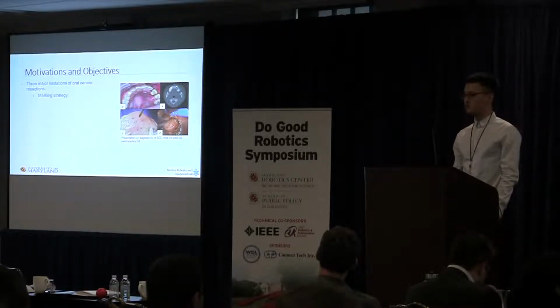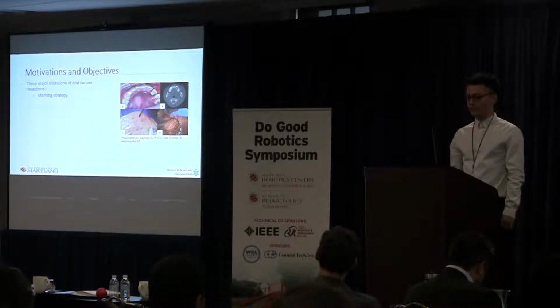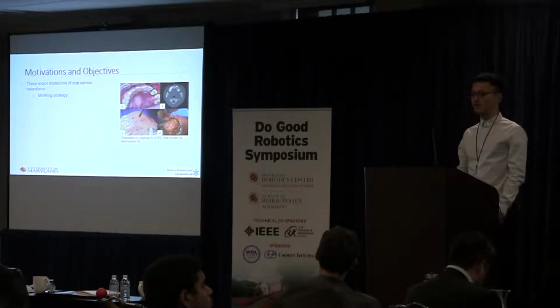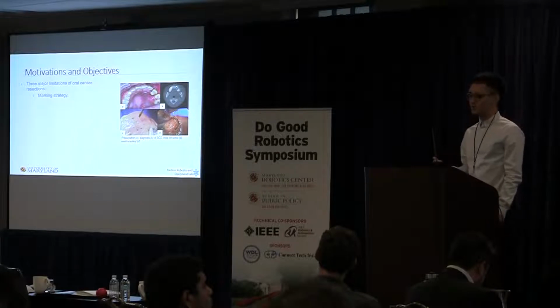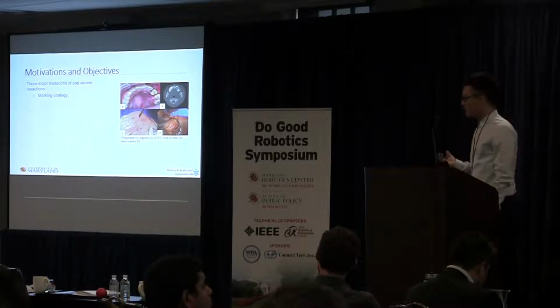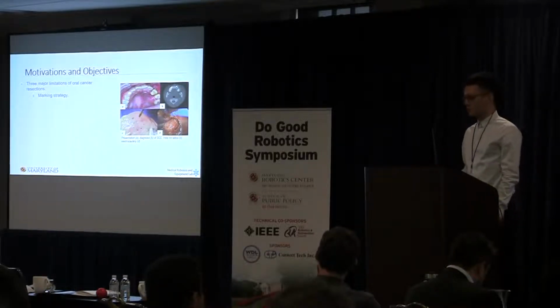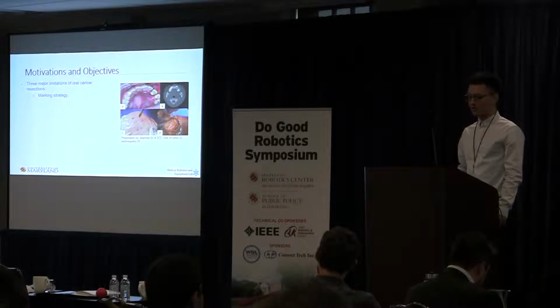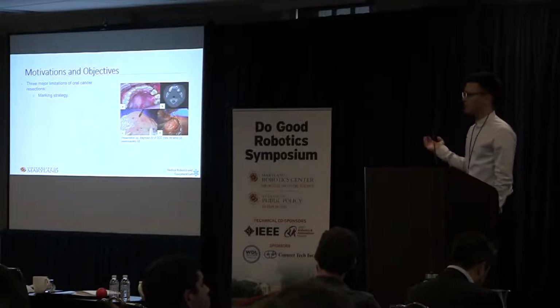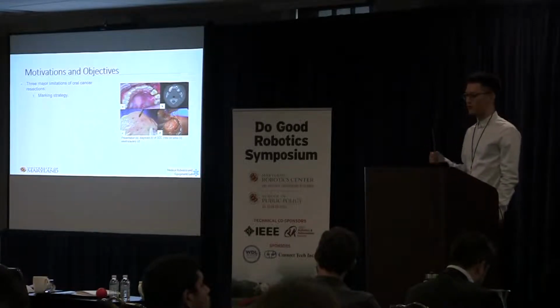As I mentioned before, surgeons rely on visual cues and preoperative images to generate the surgical plan. However, besides that, they will use India ink, shown in image C. They use this black ink to tattoo the border of the tumor to help them delineate tumor tissue and healthy tissue. However, this black ink is easily obscured by blood intraoperatively and also by charred tissue. Image D shows what charred tissue caused by the electrocautery looks like.